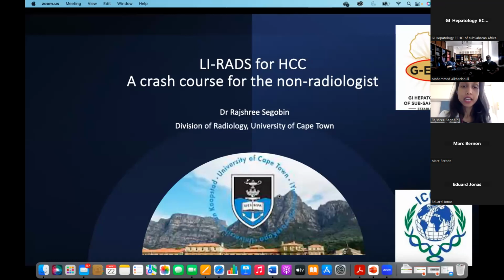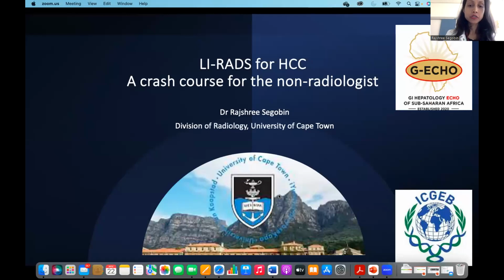Good afternoon, everybody. My name is Rajshree Segobin. I'm a registrar in the Division of Radiology of the University of Cape Town, and it is a great privilege for me today to be speaking to you on this platform. I will be taking you through a roundup of what LIRADS means in the context and management of HCC. This is intended not as a radiology lecture, so don't be worried, but more as a crash course and overview for the non-radiologist.